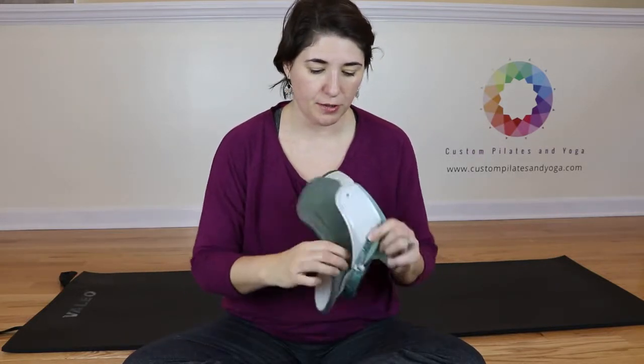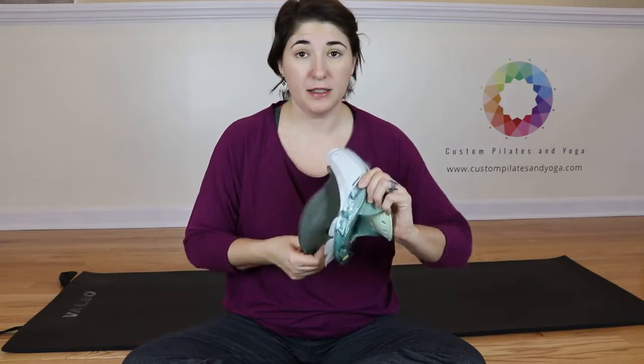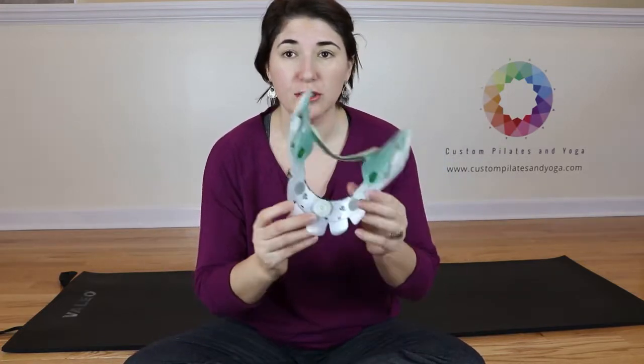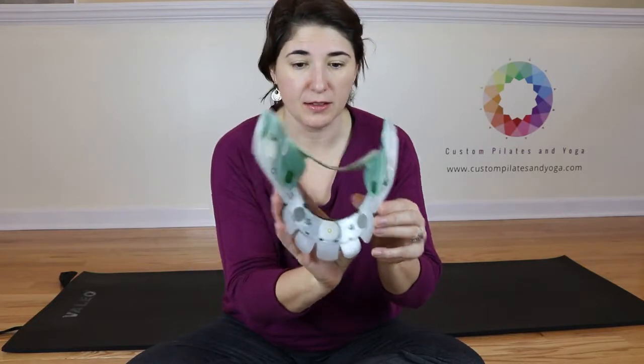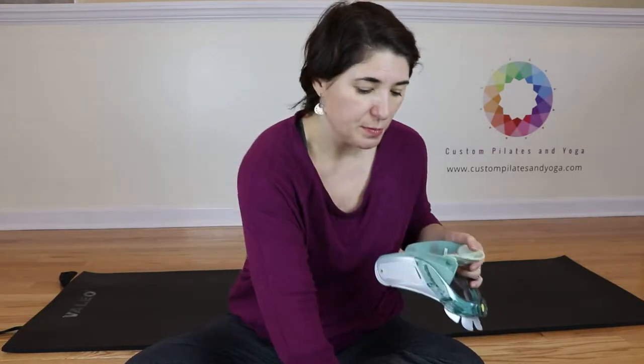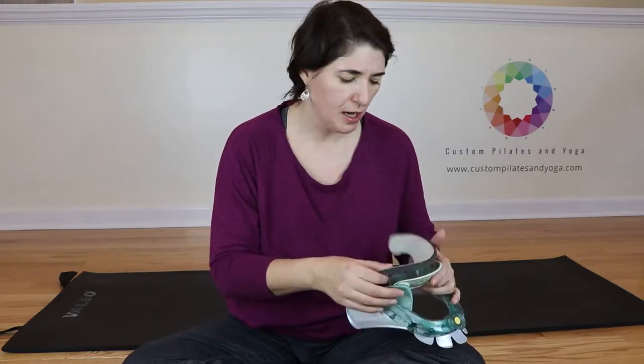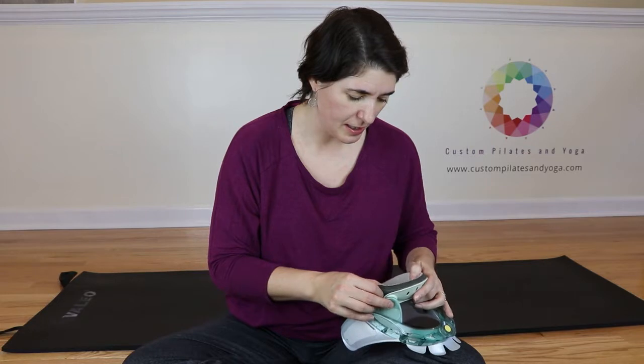And you would take off the old pads. I didn't bring my replacements with me, so I'll just put these back on. So here's what this looks like with no pads on it. And then I always put my neck one — the chin cradle part — first, and then try to get that centered.